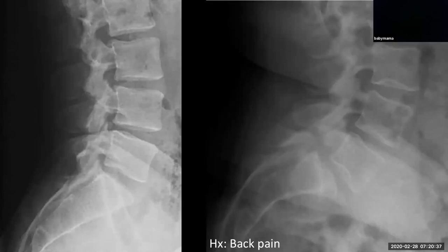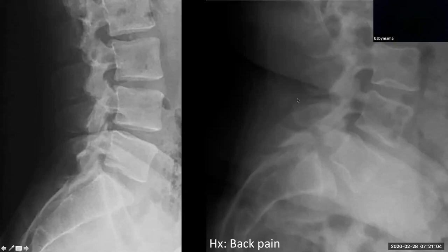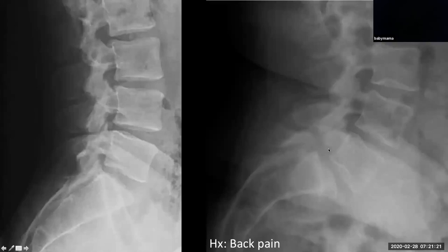There are many types of spondylolisthesis, but the main thought is that this is due to either a chronic trauma or acute event, though there are dysplastic and congenital variants. What you want to look for — the key to this diagnosis — is the alignment, that is the A of the posterior vertebral body lines. Also notice the spinous processes posteriorly are also out of alignment at L5, with a big jump off between L4 and L5 spinous processes. This is a case of bilateral PARS defects with spondylolisthesis.